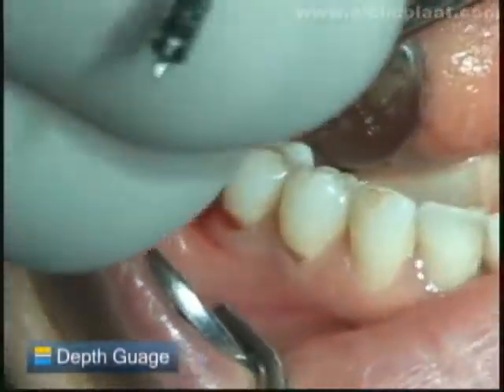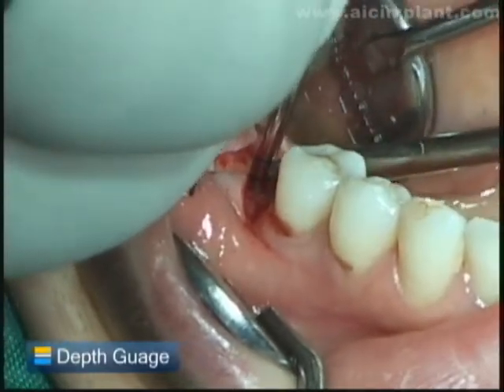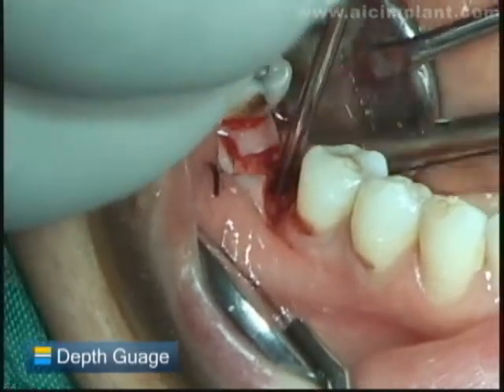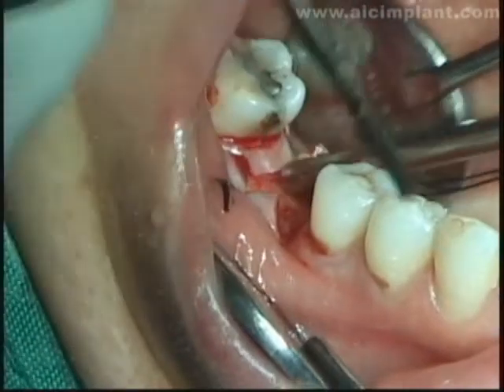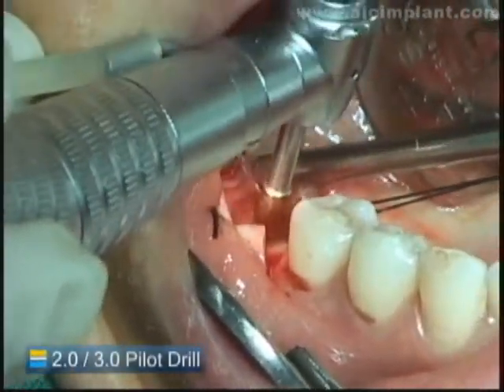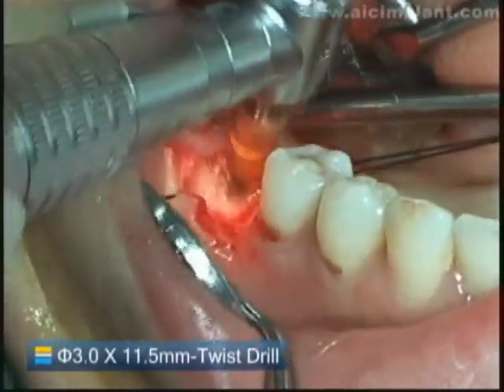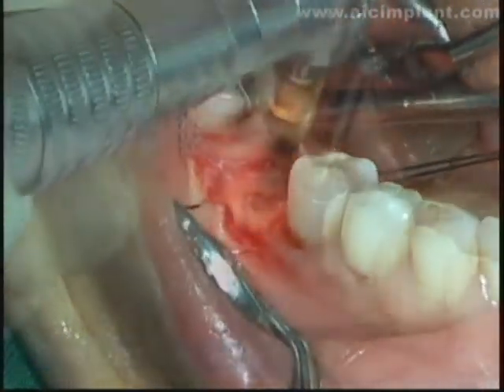The floor must be felt at 11.5 millimeters when the depth gauge is inserted into the hole. If the drill is inserted deeper than the selected drill length, the lingual side may be perforated. Drilling should be done on the stopper area.